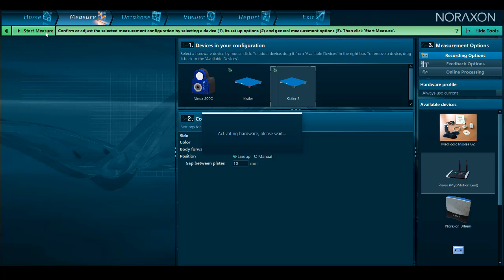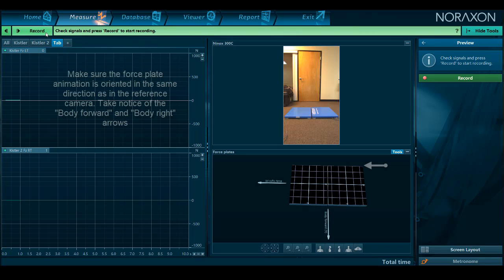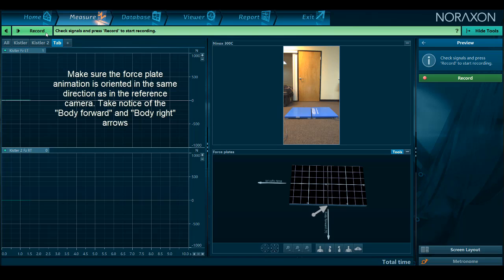It may be helpful to set up where you can see your computer screen from the force plates or have two people assisting, one to correct the configuration from the computer and the other to stand on the force plate. It may be helpful to use a reference camera during the setup, but not necessary.